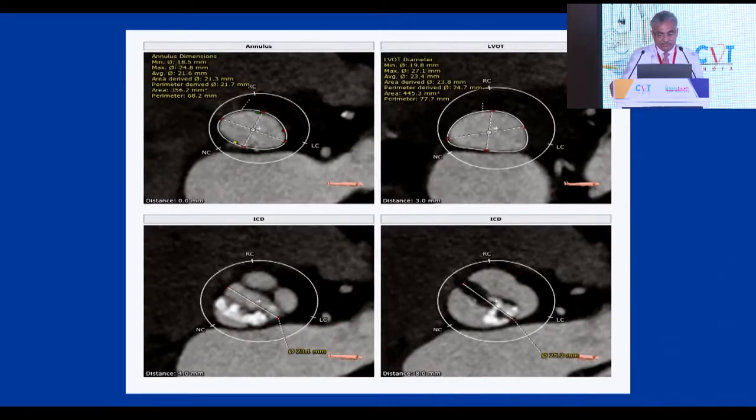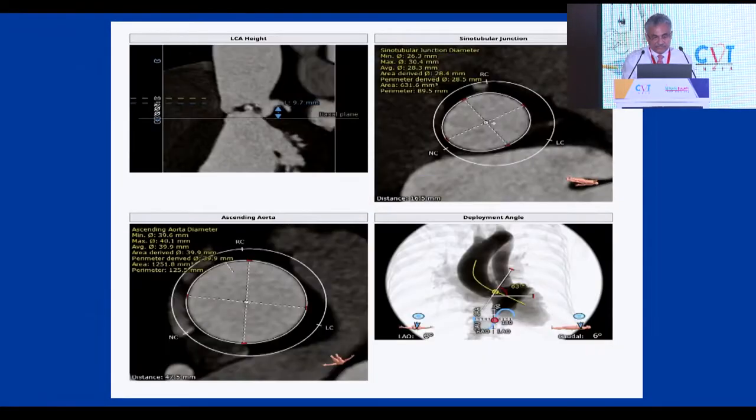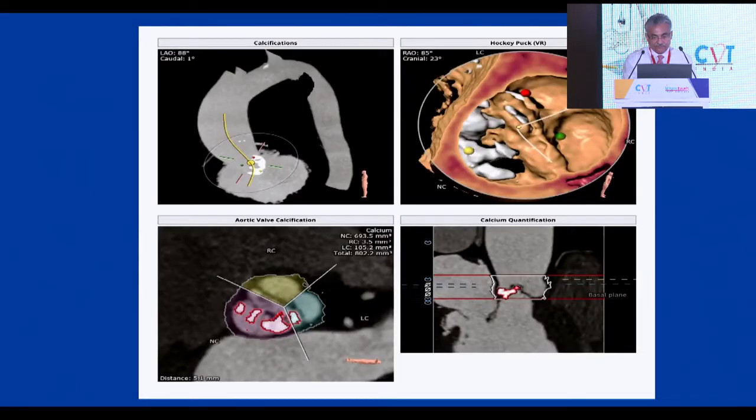So these are the CT parameters, like area derived, what we have seen. And it's a type 1 bicuspid aortic valve, where the cusp is fused and one cusp has become large and calcified. So these are the same parameters seen in different views.